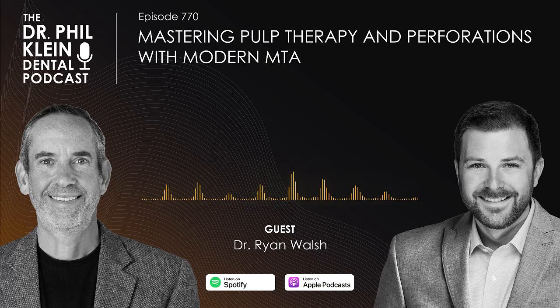So, what would you say, Dr. Walsh, to a general dentist who had a vital pulp exposure, small one, got the bleeding under control, used MTA, but they didn't want to put the restoration right on top of it at that same visit? They wanted to make sure the patient was, number one, asymptomatic, and number two, they wanted to wait and see that some dentin bridge formation was occurring, and then they would go ahead with the final restoration. What's your thought on that?